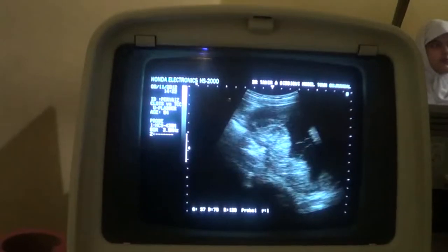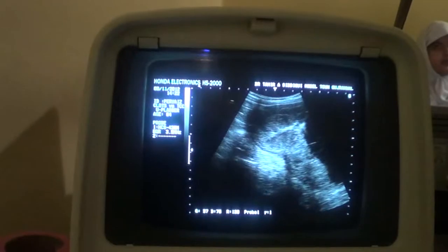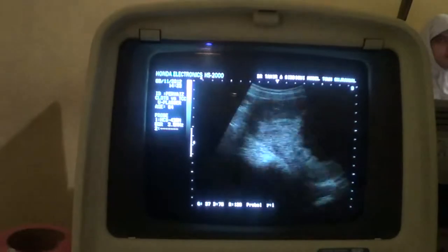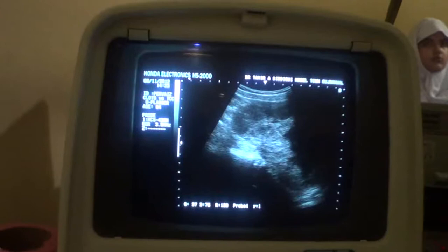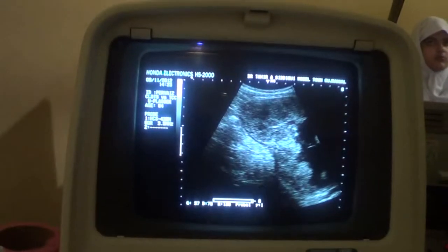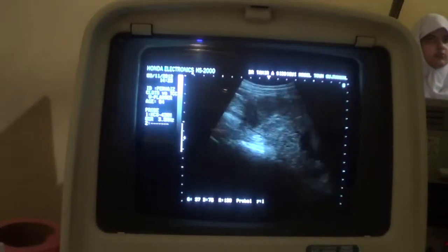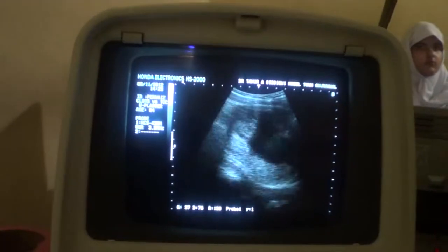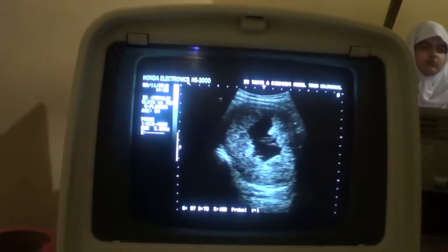And now let's see. I don't see on ultrasound that it's invading the wall of the urinary bladder, as the wall of the urinary bladder is seen almost spared, or is not penetrating, and the posterior not yet, it's lateral. This is the urinary bladder wall. Similarly, at its lateral angle, lateral wall, here we are.